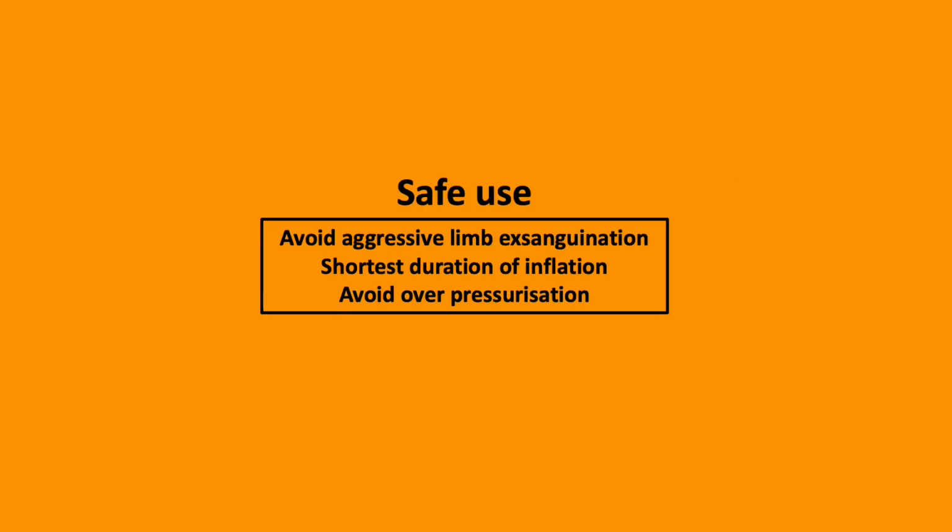Key points for tourniquet safety include: avoid aggressive limb exsanguination, use a tourniquet for the shortest duration of time, and avoid overpressurization.